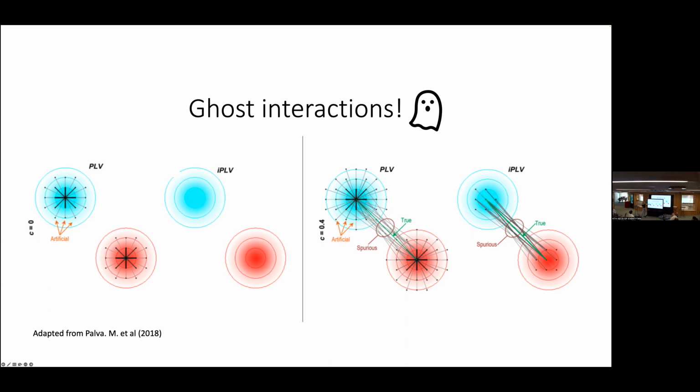So those can't be removed. That's what you see furthest to the right. Of course, these connections are correlated, so you can group them into just one edge. But what happens is that you reduce your spatial resolution a bit, because you don't actually know where the center is.